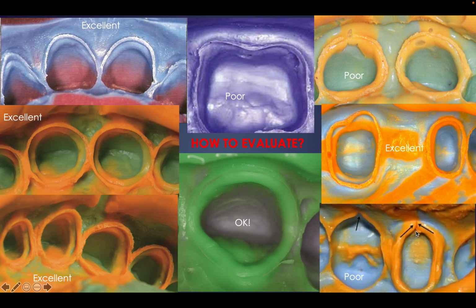This is a drag. You see, there was a pull, there was an air bubble or unsuccessful impression of your margin in this area and in this area, which is part of your margin. So you have to repeat the impression.